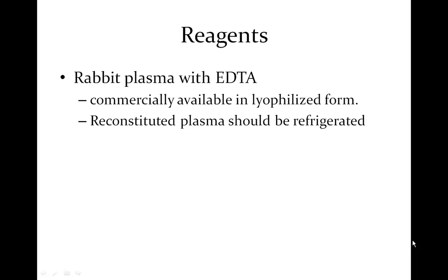So what do we need as a reagent for this test? We need rabbit's plasma with EDTA. It is available commercially in lyophilized form. We have to reconstitute it, and reconstituted plasma can be kept refrigerated.